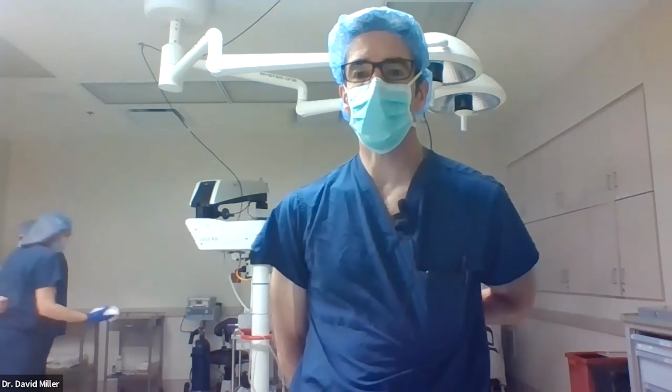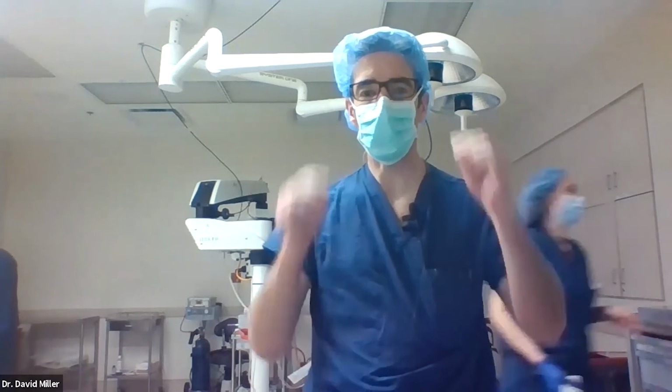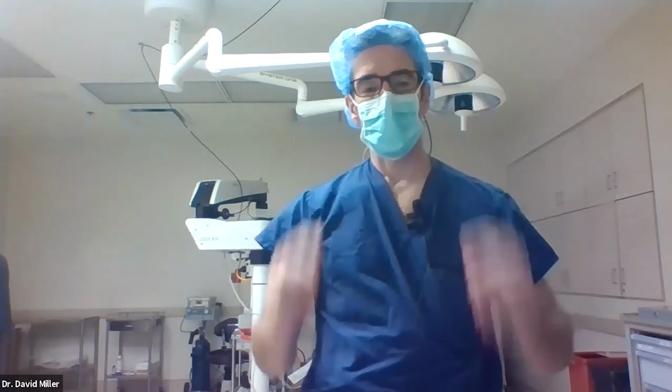What are the indications for vitrectomy and scleral buckle? Really, it's surgeon preference there. If you feel you're getting better success with buckling all your vitrectomy patients, I would tell you to go ahead and do that. It's more surgical trauma. It lengthens the case. There are more steps involved and risk of complications: perforation of the eye, diplopia, patient discomfort. But if that's giving you a better outcome, I'm certainly all for it.